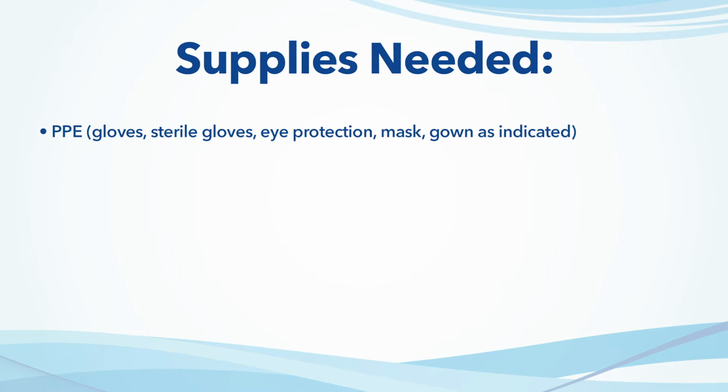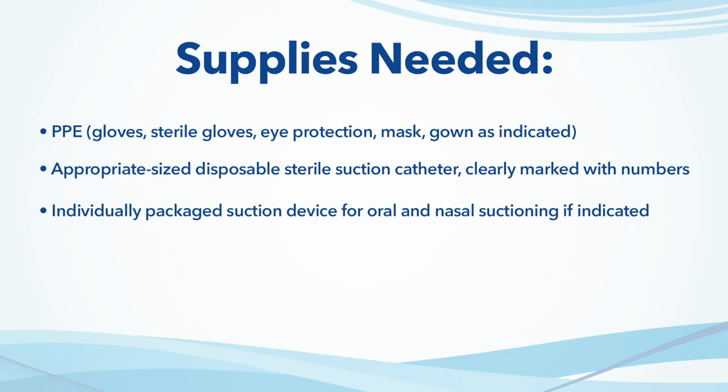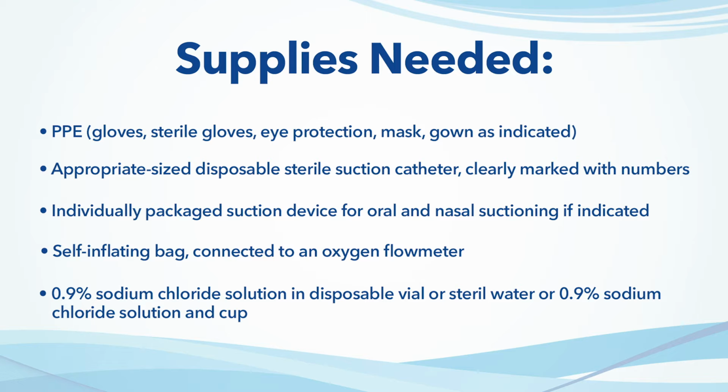Personal protective equipment, or PPE: gloves, sterile gloves and eye protection, mask, or gown as indicated. Appropriate sized, disposable sterile suction catheter, clearly marked with numbers. Individually packaged suction device for oral and nasal suctioning if indicated. Self-inflating bag connected to an oxygen flow meter. Normal saline in disposable vial or sterile water.